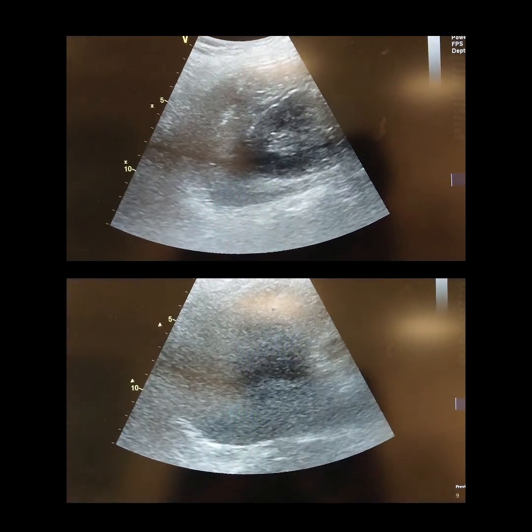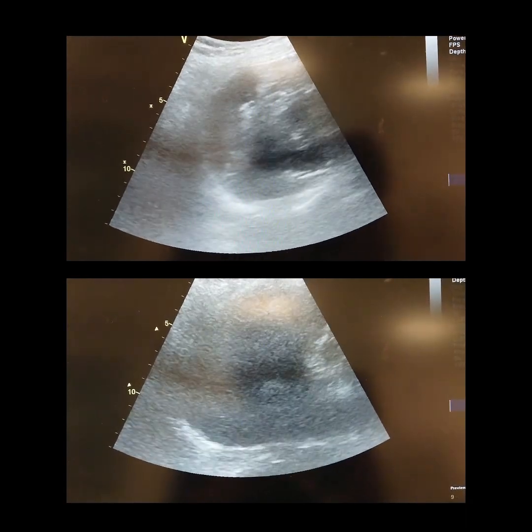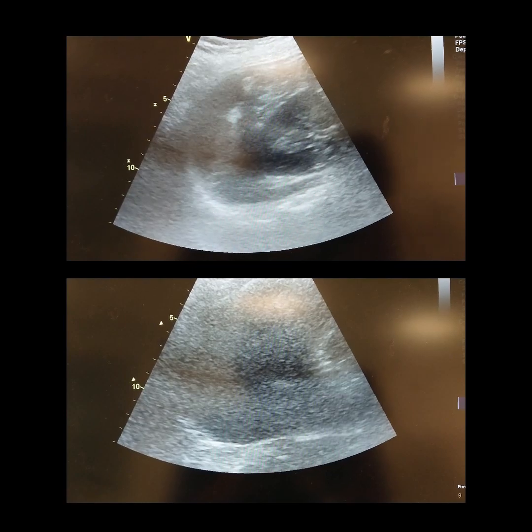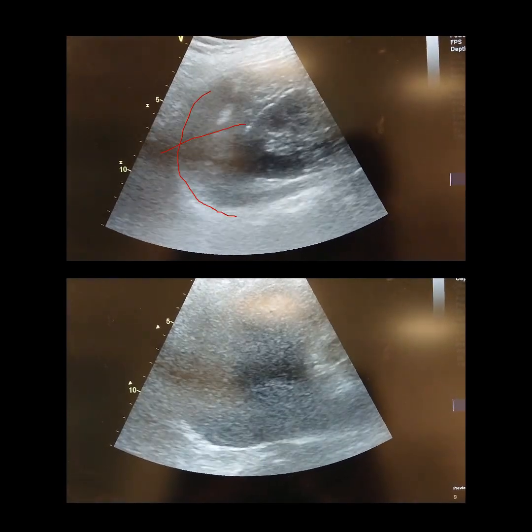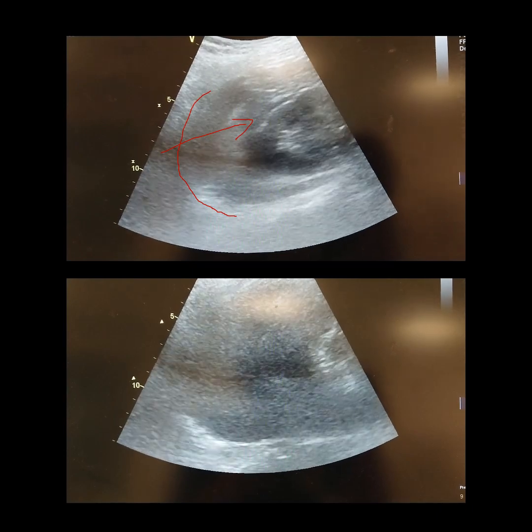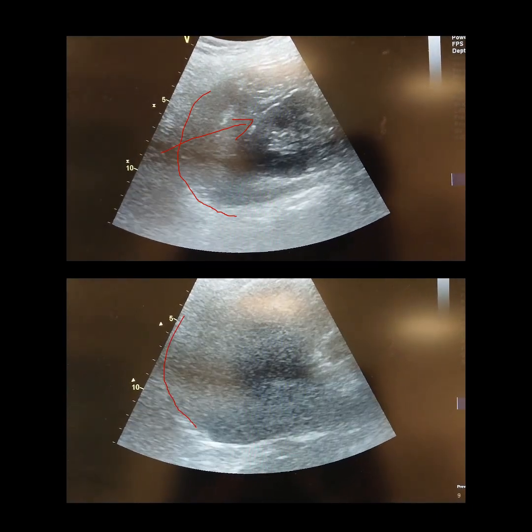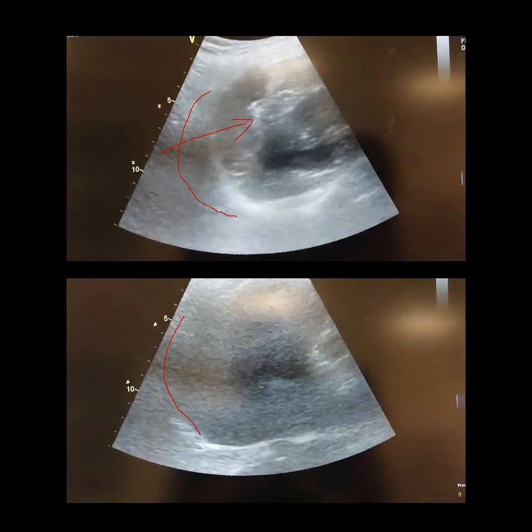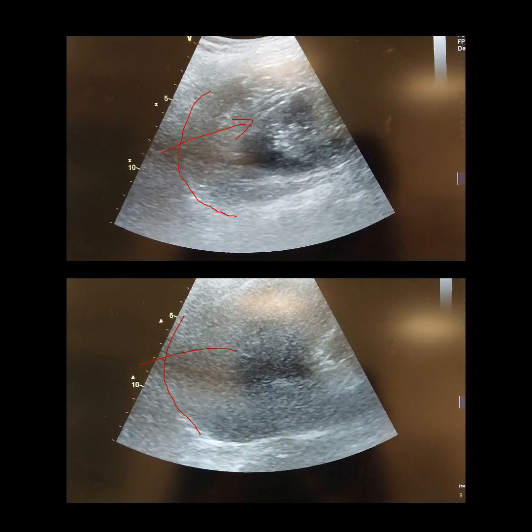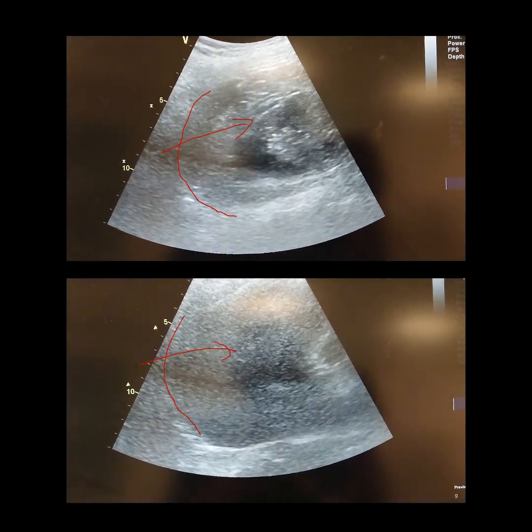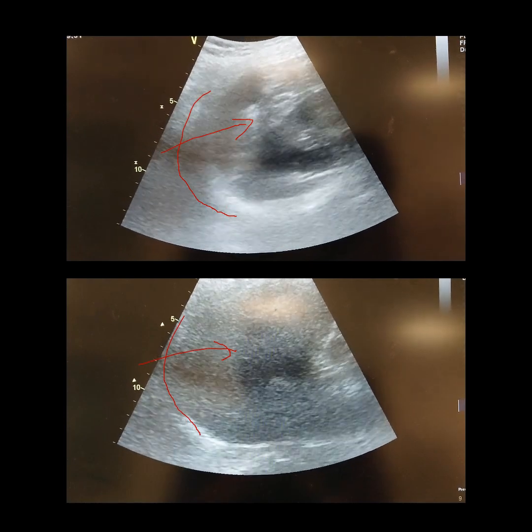On the normal side, you can see downward movement here when the patient inspires. However, on the right side of this patient — even though she is breathing so hard as you can see from the outside — there is no movement at all. No curtain sign, nothing. So we suspect there may be an abnormality on this side.